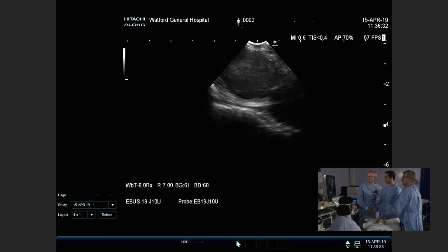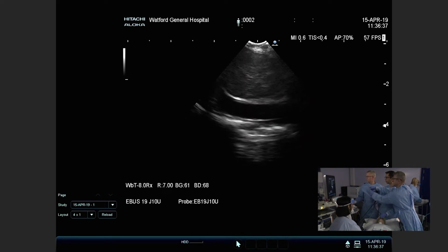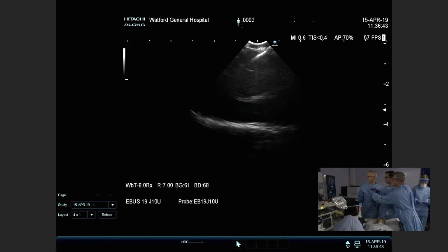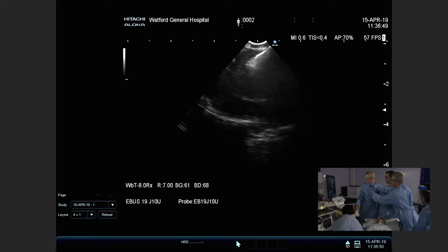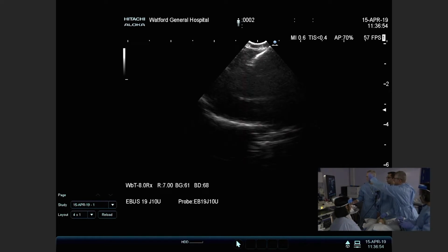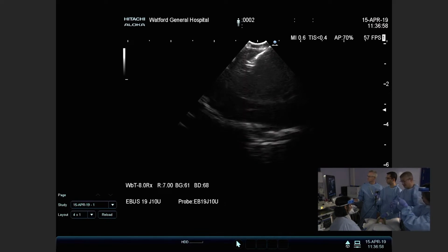And that's 4R in action again. Sorry, Andy, it's slightly loose. And that's perfect. So, needle. Yeah, go for it. Brilliant. So, again, a few movements in and out with the stylet ensures that you displace any mucosal plugs which may be sitting in the tip of the needle.